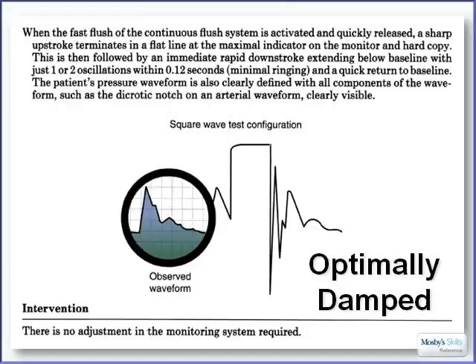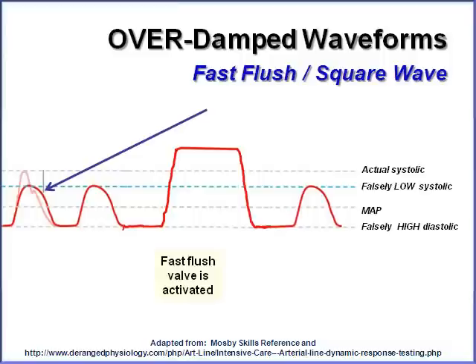Here's another example of an optimally damped waveform. You can see the dicrotic notch clearly. When you squeeze the pressure device on the tubing, you get one to two oscillations after that square wave — it dips below the isoelectric line and then bounces one or two times.